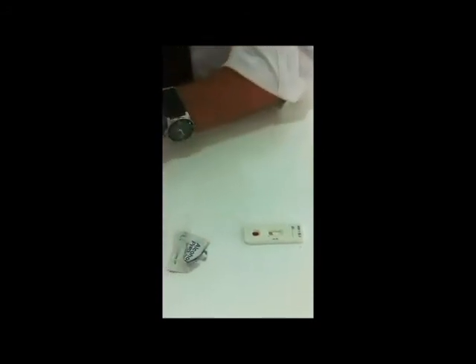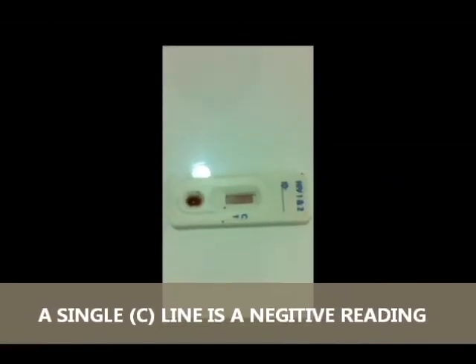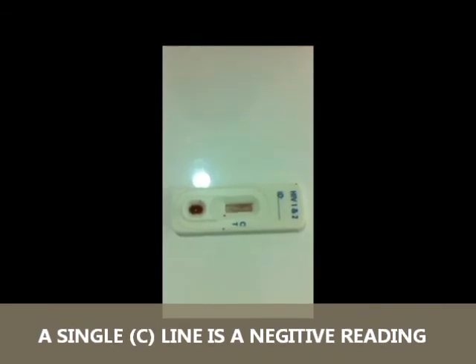As you can see now, the blood is transpiring up the test membrane. Looking closely, it's very similar to a pregnancy test kit. There's the C line — the C line is a control line, which means that the test is valid and is working. Each time you must get a C line. The C line is now visible, which means we now have a valid test.